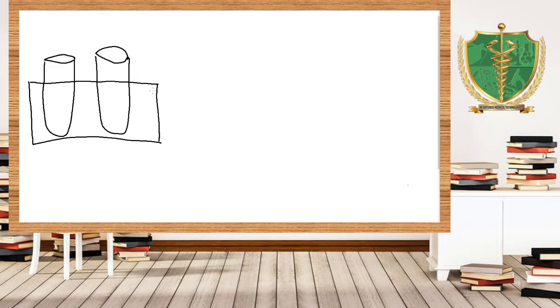Usually yung mga rack may label naman siya. It can be A, B, or 1, 2, 3, depending on the manufacturer. So let's say this is our rack 1. Now rack 1, or you can write A1, meaning rack 1 position A. So this is our sample.